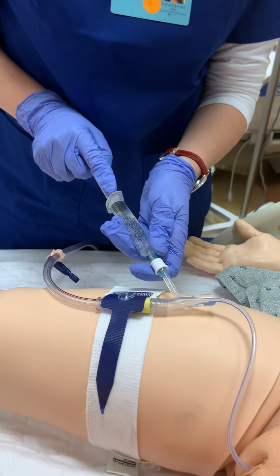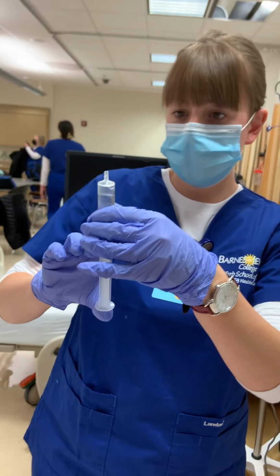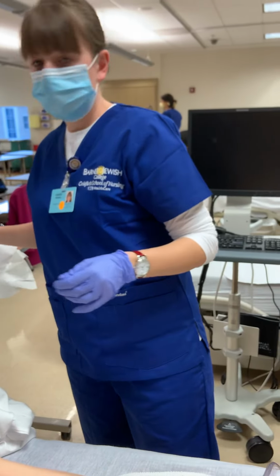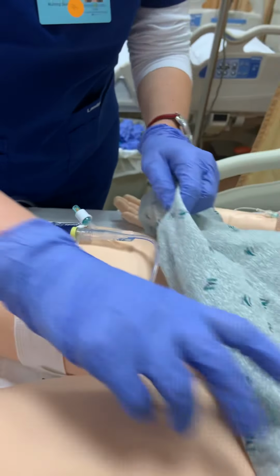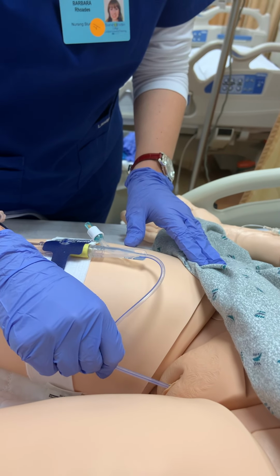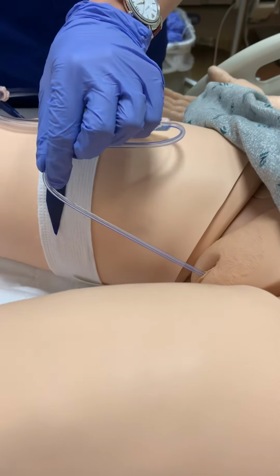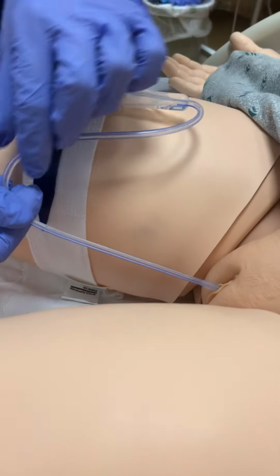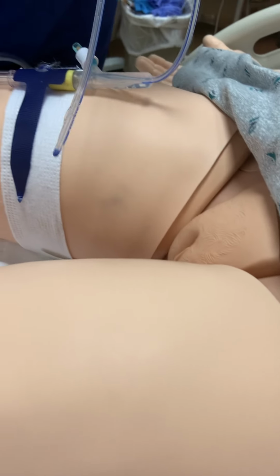All of that water out. Yep, we have the 10 mLs in here. That's what we should have, which tells me that the balloon should be deflated. So I'm just going to lift up your gown. There'll be a slight tug. Okay. I have a towel here while I'm pulling it out to catch any urine that may come out at that time.